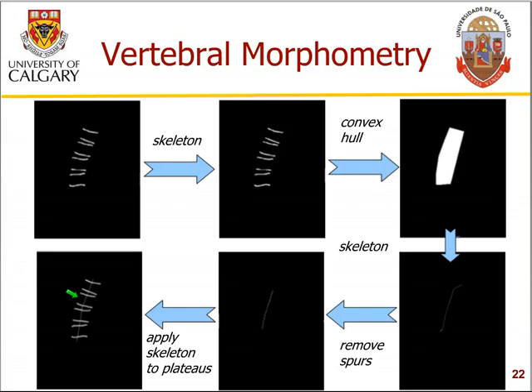Now, this was extended and superimposed on the result of detection of the vertebral plateaus. The reason or the need for this line is to have a central reference axis for the region covering L1 through L4. So now we have for each vertebra the central line.